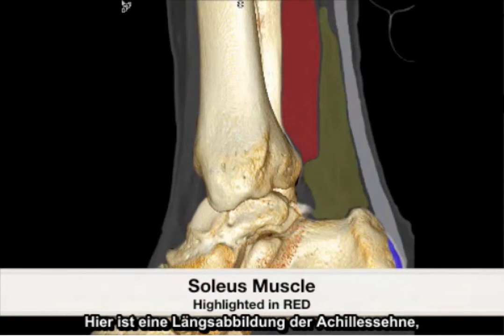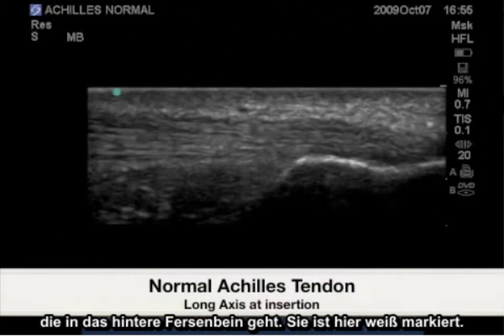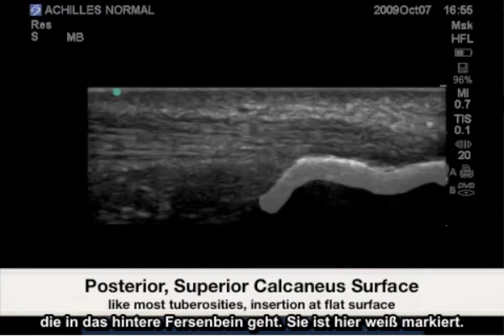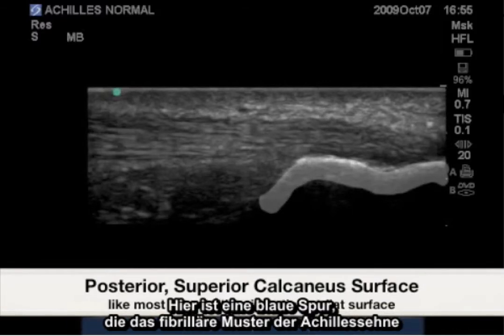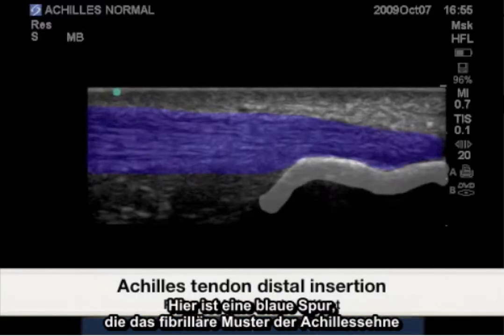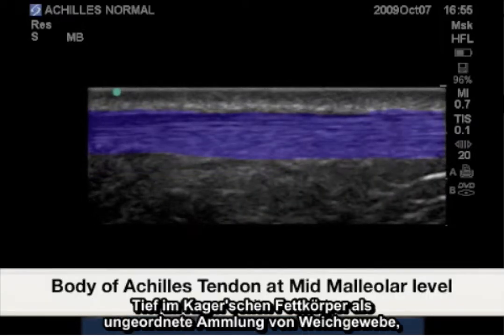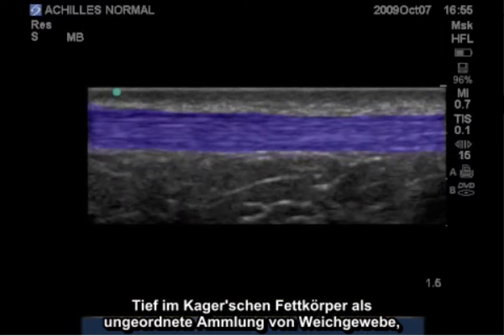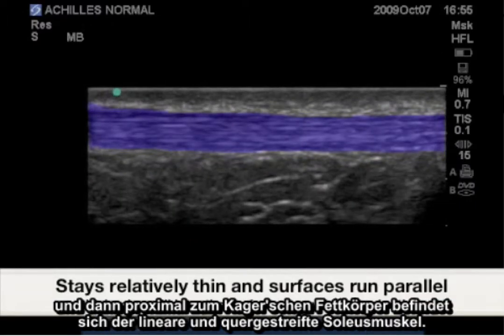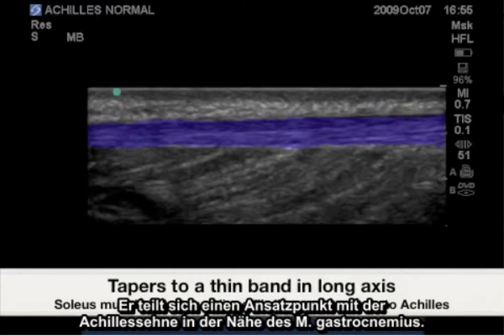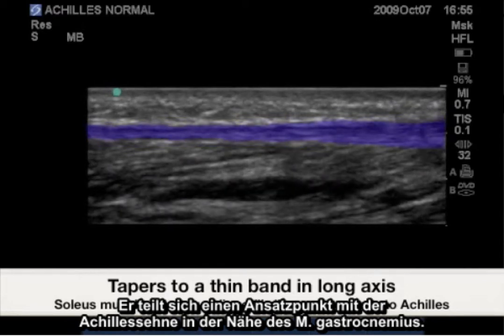Here is a longitudinal image of the Achilles tendon inserting to the posterior calcaneus highlighted in white. The trace in blue represents the Achilles tendon fibrillar pattern as longitudinal linear striations. Deep to this is Kager's fat pad as an unorganized collection of soft tissue. Proximal to Kager's fat pad is the linear and striated soleus muscle as it also shares insertion points with the Achilles tendon near the gastrocnemius.